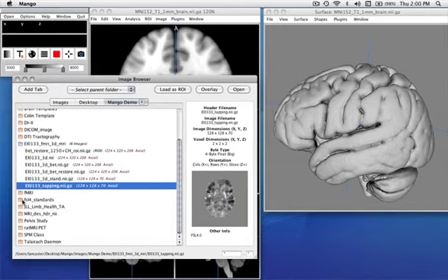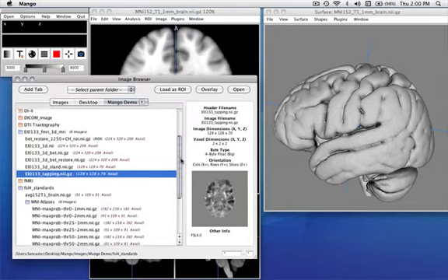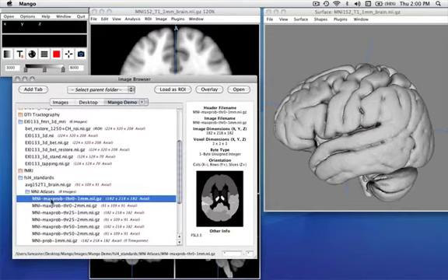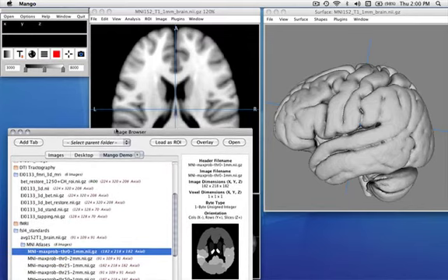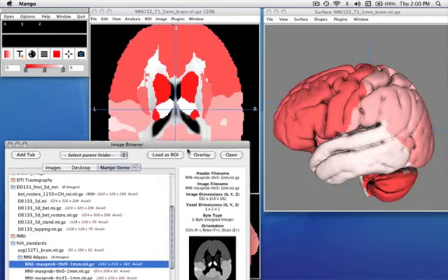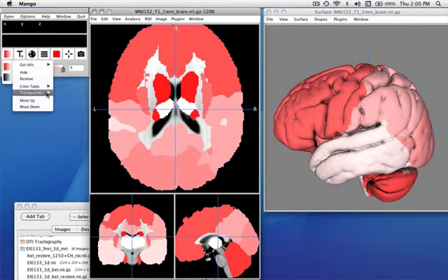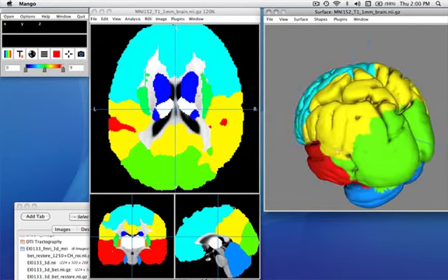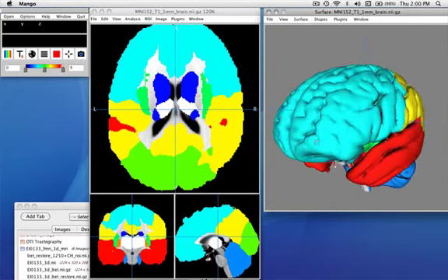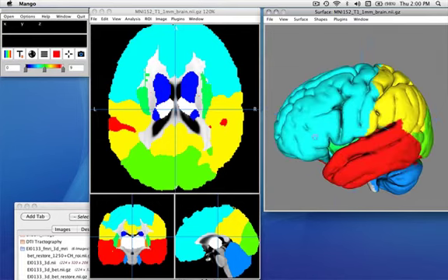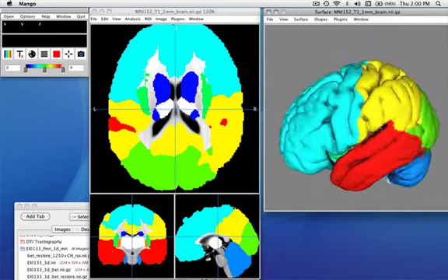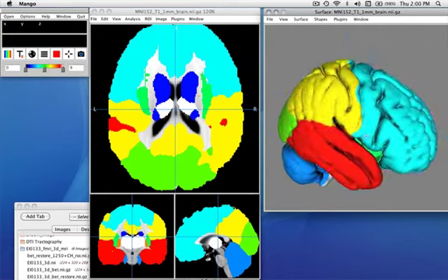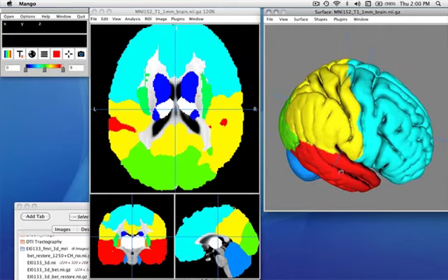Also from this website are a number of atlases that we can use to overlay. These atlases are basically images. I'm going to overlay this particular atlas and change the color a bit. We have a nice color distinction of the major lobes determined in a probabilistic manner. You can see the central sulcus well here and on this side, and you can see all the lobes and the cerebellum.